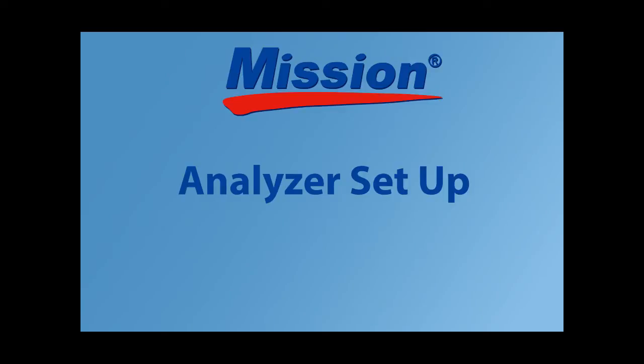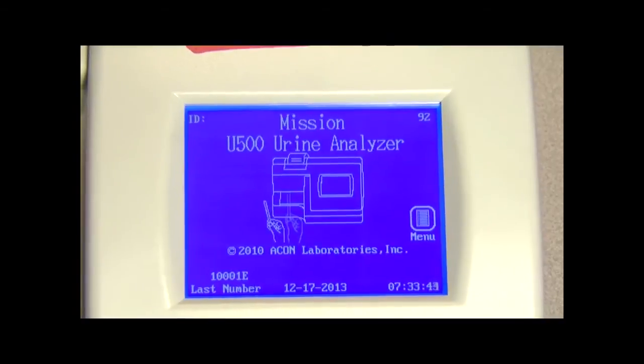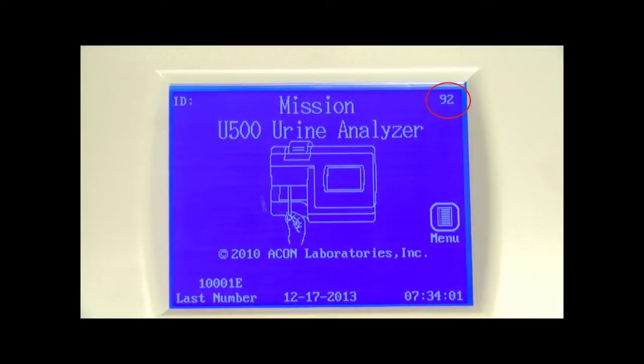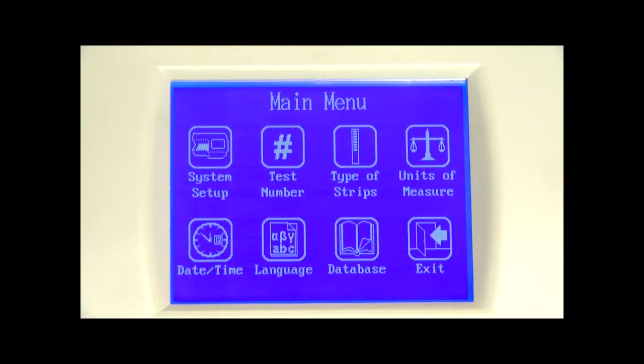After powering on the analyzer, the initial screen is displayed from which strip testing operations are normally performed. A screensaver will show after 10 minutes of no activity to reduce the possibility of any permanent image on the screen. Press the number in the top right corner to show the canister code input screen for entering a new canister code. Press the top left corner for user login. Press the paper icon to display the main menu screen, which provides the analyzer setup options to customize the analyzer for a particular testing site.